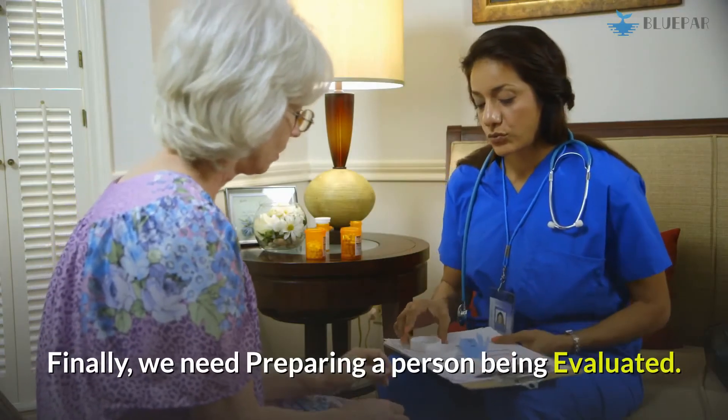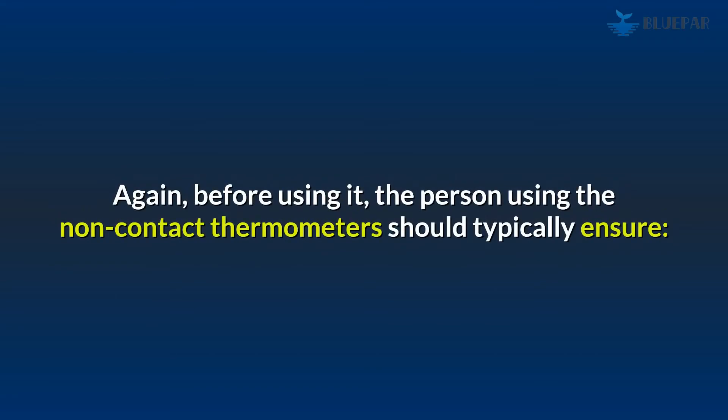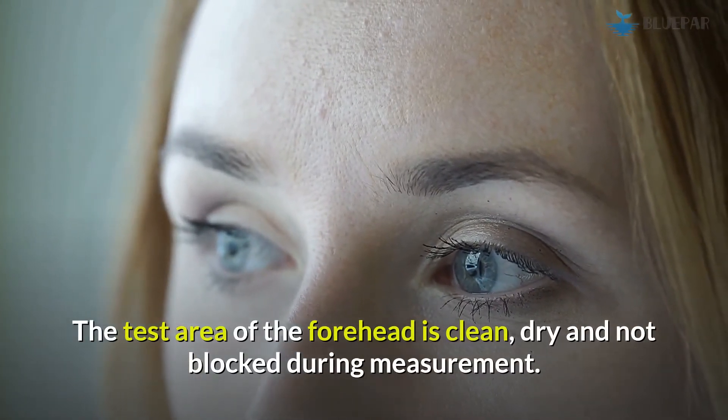Finally, we need to prepare the person being evaluated. Before using the thermometer, ensure the test area of the forehead is clean, dry, and not blocked during measurement.